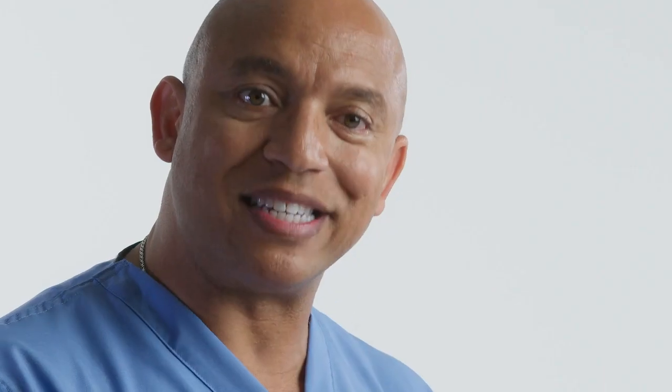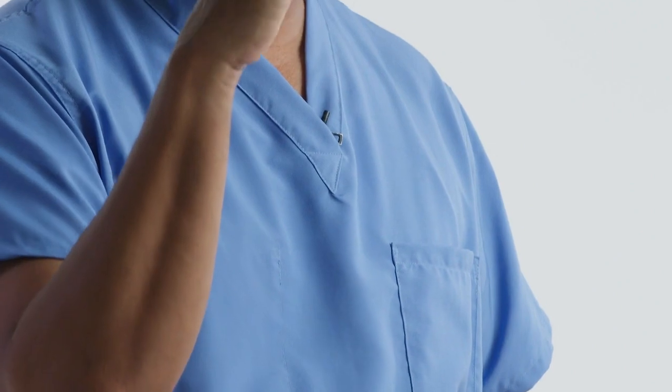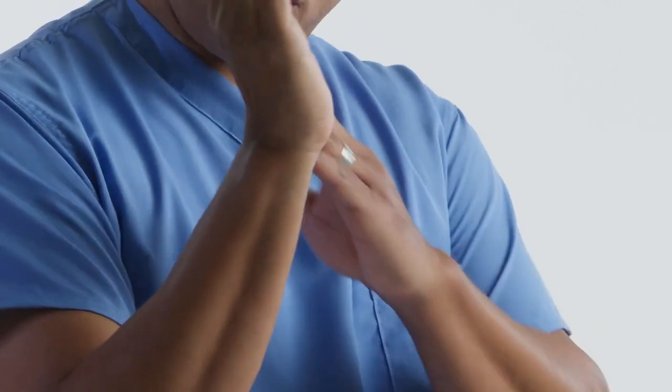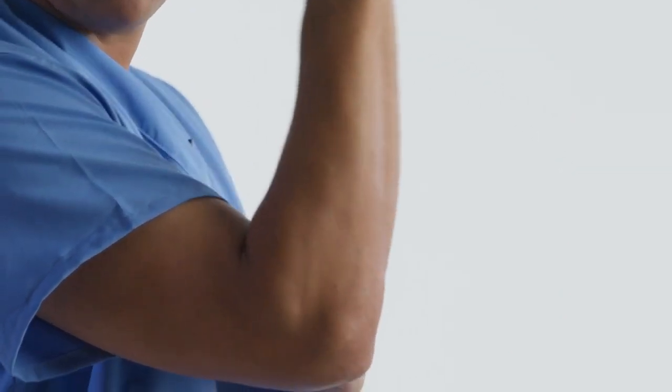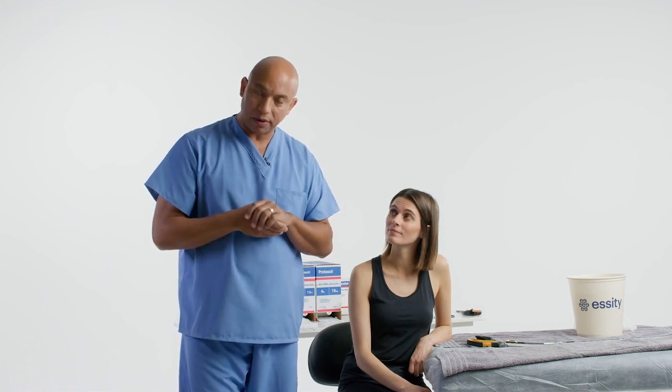For this particular splint, the injury is a distal radius fracture or a very bad injury to the wrist. Our goal is to stop supination and pronation of the extremity and stop flexion and extension. It also limits extension of the elbow — it will not allow for full extension. If you need to stop elbow extension entirely, you need to add the double sugar tongue.